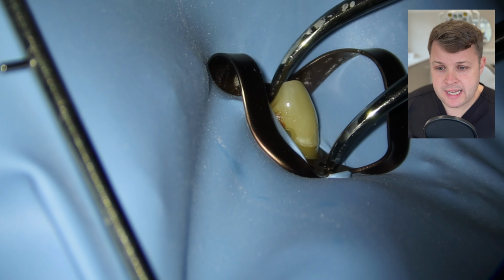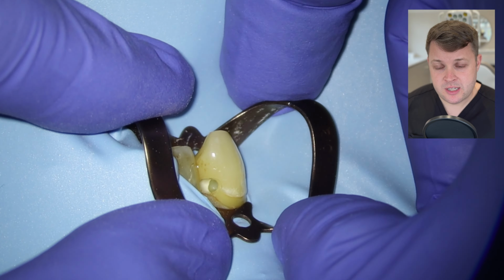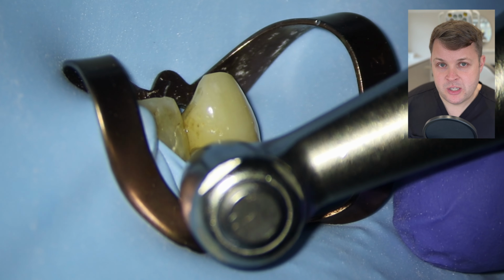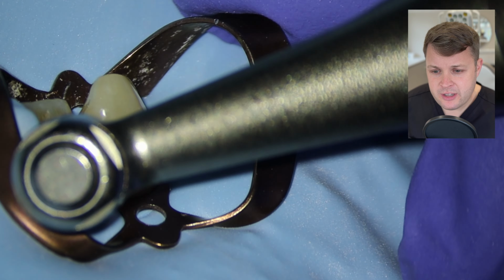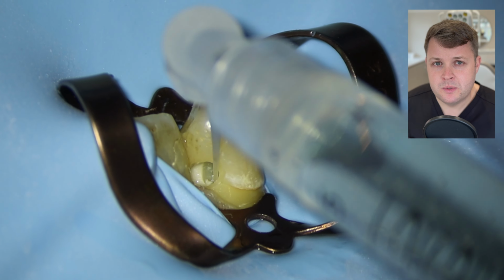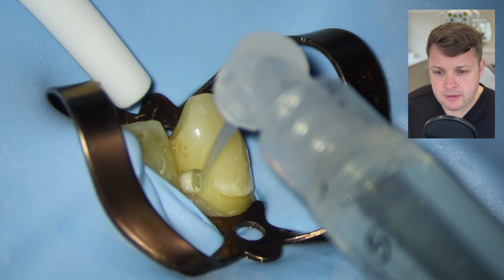We need to get rubber dam on. And hopefully when we place this rubber dam on, because I'm now thinking about having the access cavity mesially, there's going to be enough space to get in there, and there is. So I'm just going to give the cavity a little bit of a tidy up with my rose head and also my fast handpiece, and then straight away I'm going to irrigate.